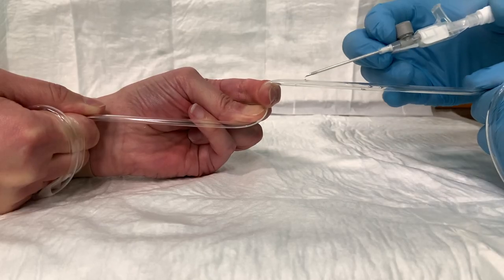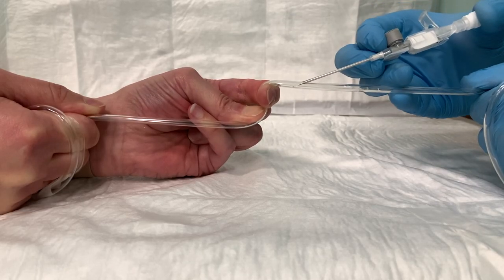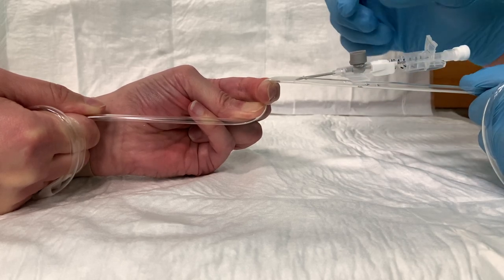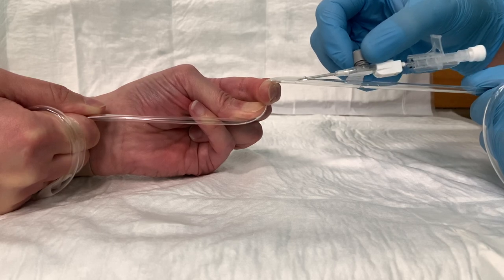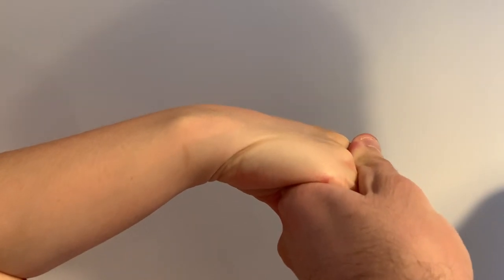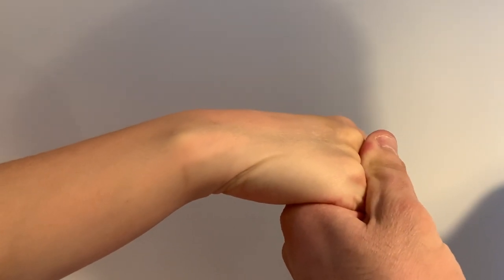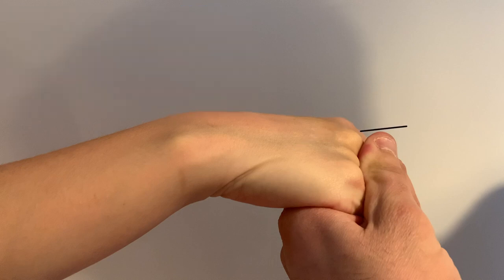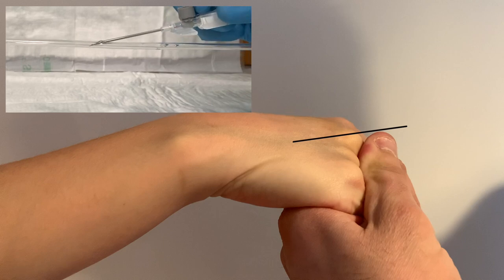If you insert into a vein with a junction very close proximally, you'll probably find you can't advance the cannula. Choose a long, straight vein, avoid inserting too close to a junction or valve, and pay attention to your insertion angle — if you go in too steeply you'll invariably pop out the back of the vein, causing transection. A very shallow approach angle is more than enough to get the bevel and plastic cannula tip into the vein.